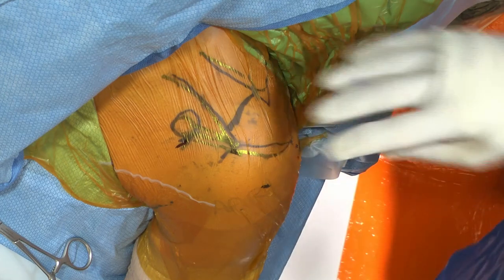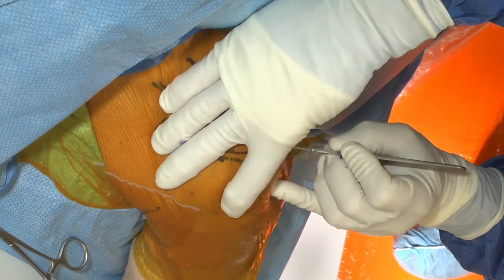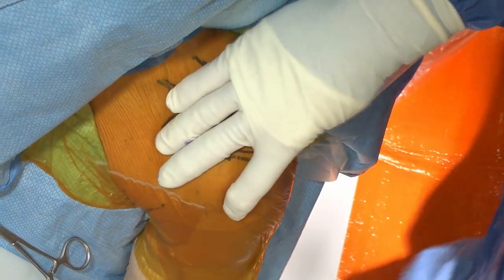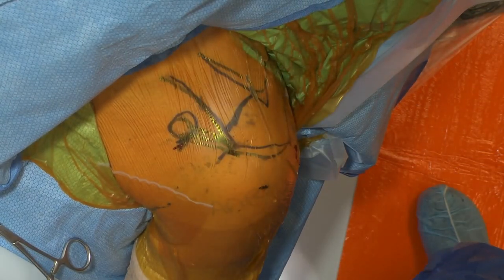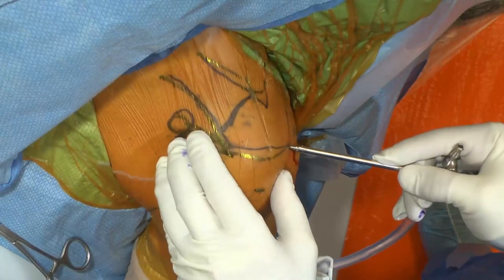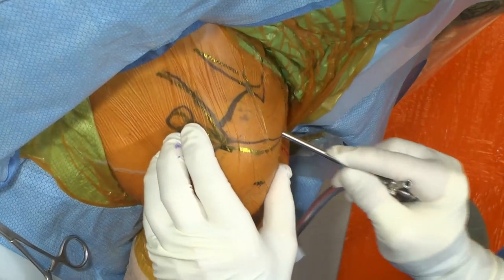Incision, blunt scope. We'll go ahead and, without distending the joint, insert our trocar into the glenohumeral joint.